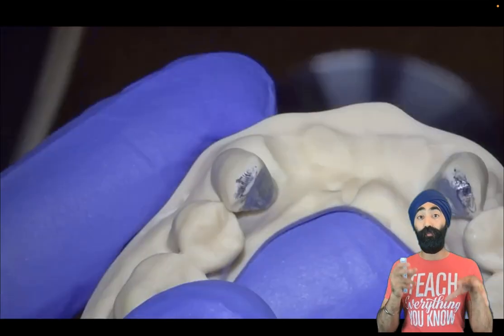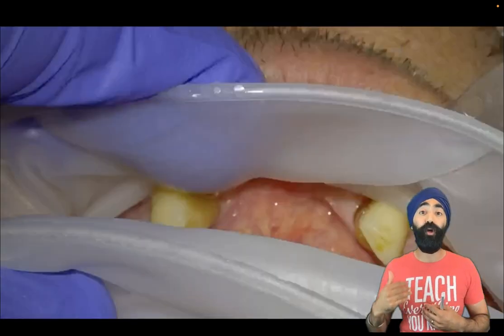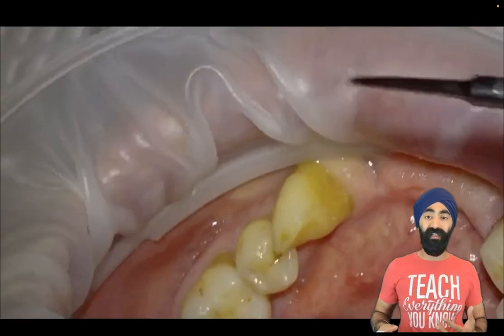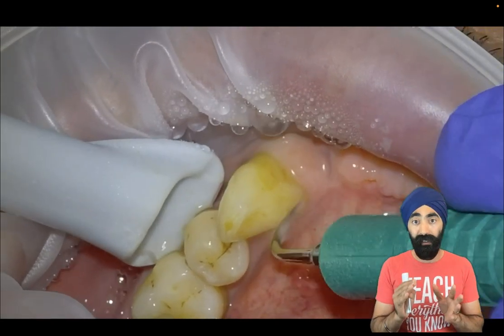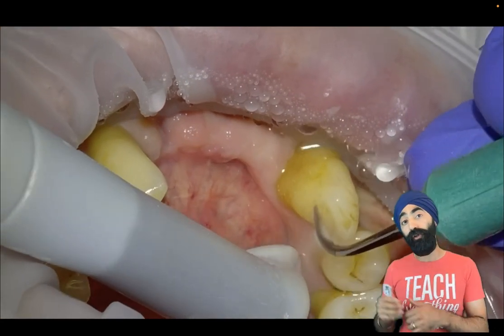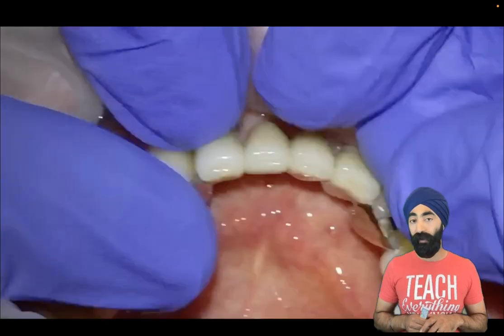Here I am checking the actual bridge itself in the mouth — just getting a rehearsal. I'm always checking how I'm going to place it on and checking the quality of the fit. I then place an Optragate for situations like this. I don't tend to use a rubber dam. I'm getting my area super clean — you can't bond to stain. So any stains I'm getting rid of using my ultrasonic scaler, my Cavitron. And later on you'll see me using the air abrasion unit. I'm very, very meticulous here in getting rid of any staining because you just cannot bond to stain.